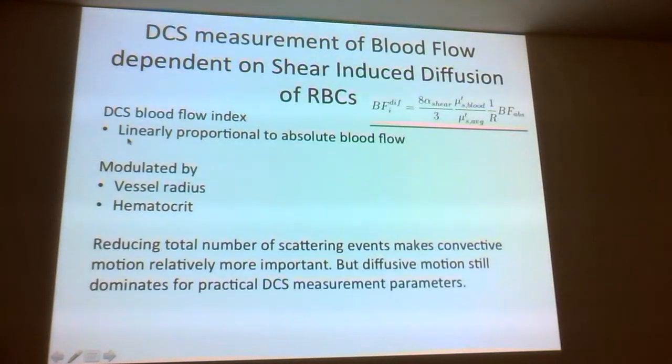Okay. So when you change hematocrit, you reduce velocity? No. We changed hematocrit, we kept velocity the same. Okay. So it's kept the same, but the decay rate decreased. And the decay rate decreased because the probability of scattering from a red blood cell actually decreased. But if you raise hematocrit and velocity is the same, then blood flow is increasing, isn't it?